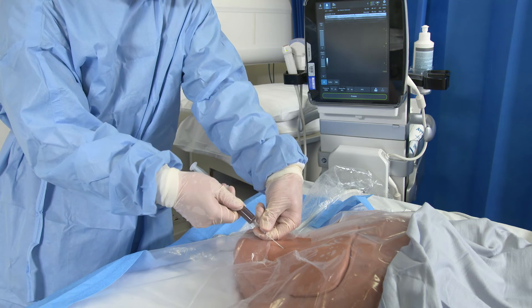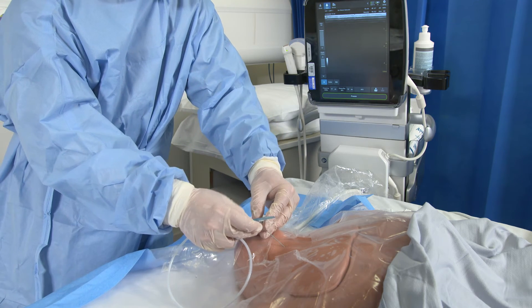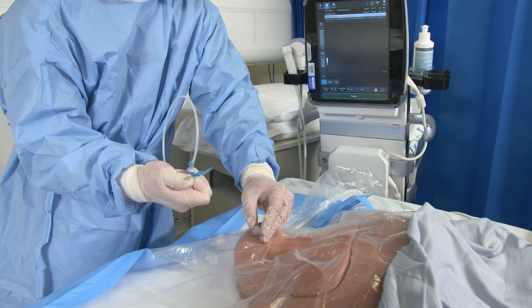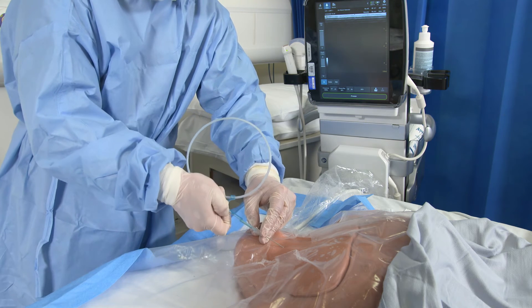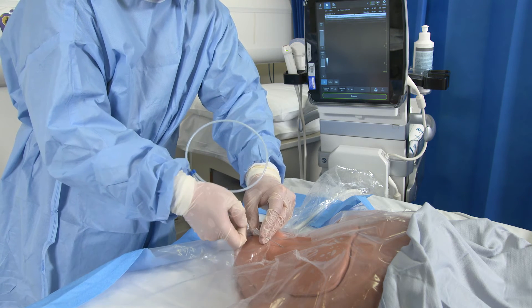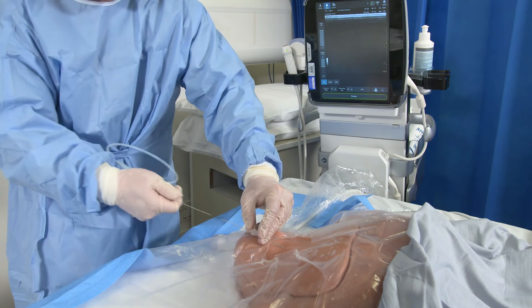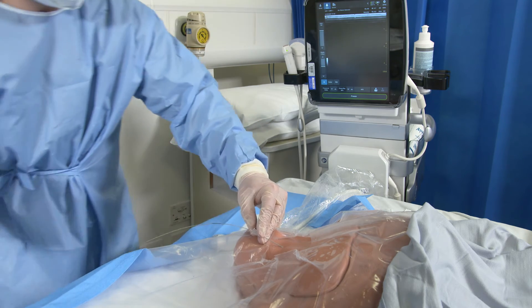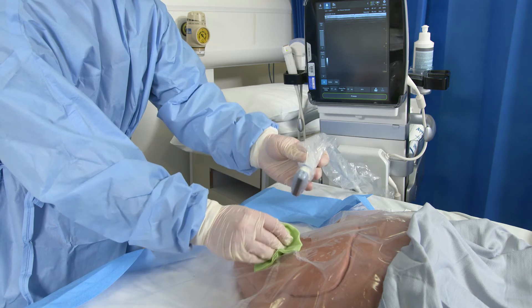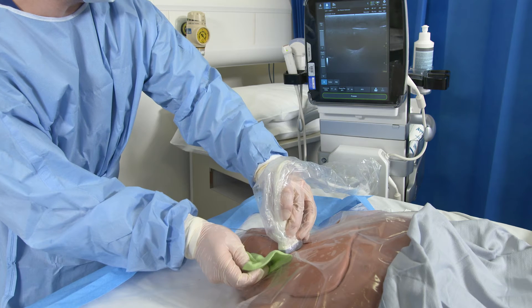Once you're in the vein, remove the syringe and cover the tip of the needle with your thumb. The guide wire has a bend in the tip that is useful for guiding it into the vein. Insert the guide wire down the needle — it should pass easily into the vein. There are measures on the guide wire to show how deep you've gone; when you get to the second or third one, it's usually enough. Remove your needle over the guide wire and then use the ultrasound to confirm the wire's position in the vein.